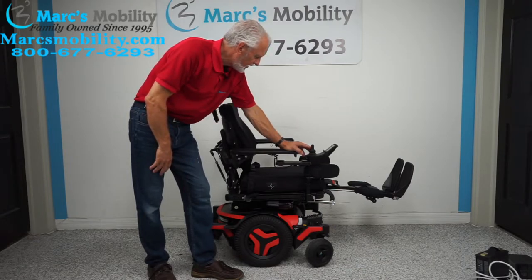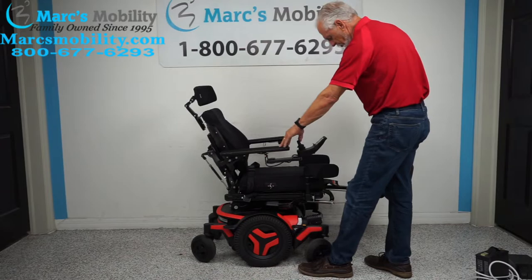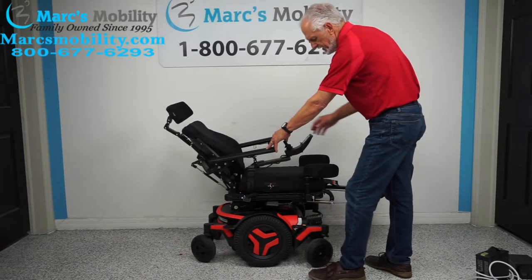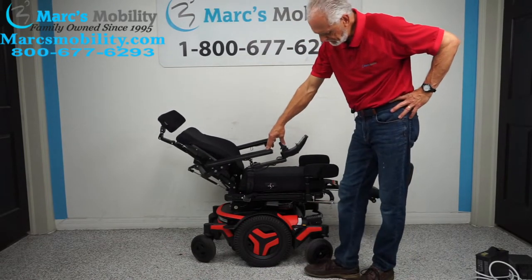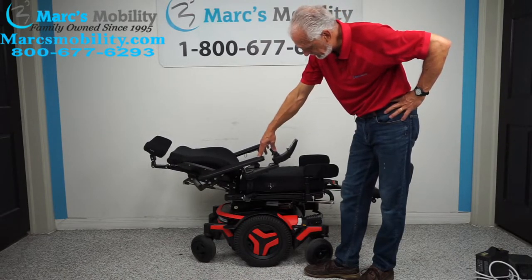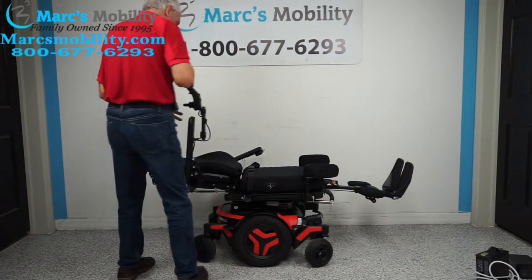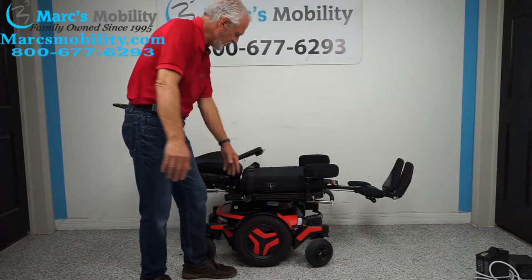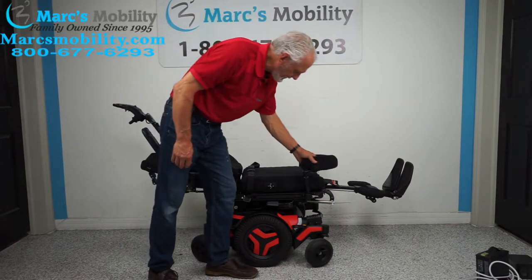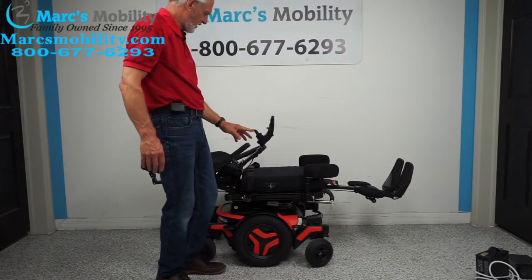Now we're going to do the recline. The recline is just the back going back — you can see the back is going back by itself, with nothing else moving in the chair. This is called electric recline. Twenty years ago this wasn't available. This chair has a full recline. You can raise the arm out of the way so if you transfer from the side, you can move the arms out of the way. These lateral pads can also be moved out of the way by raising the handle.